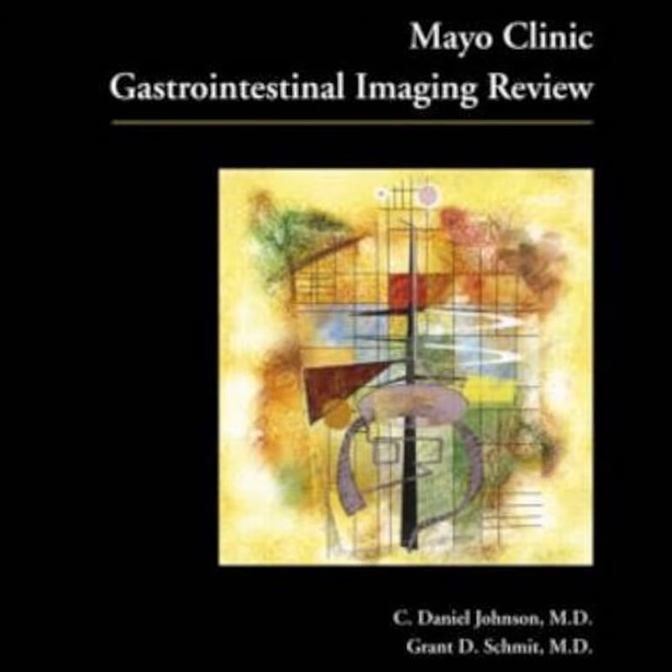Dynamic imaging also reveals hidden vascular dynamics, which is super cool. There's an ultrasound case in the book showing what looks like cystic thickening of the gallbladder wall, just multiple fluid-filled spaces that you might mistake for severe inflammation. But when you apply color Doppler, those spaces just light up with vascular flow, because they aren't cysts at all. No, they are gallbladder varices, dilated collateral veins. And the underlying cause of those varices is blood backing up due to portal venous hypertension, commonly secondary to liver cirrhosis. So you are looking at the gallbladder, but you are diagnosing a failing liver.